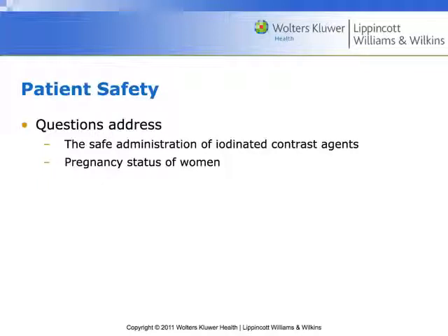The CT power injector, it's got pressure limits that are well above, for example, the pressure in your car tire. Pressure in your car tire is like 30 PSI, right? That's what keeps your car going down the road. I might be hitting 200 PSI on my power injector, right? If you can imagine that sound that it makes when you push down on your tire and all the air flies out, that's air flying out, right? Not contrast. Contrast is borderline heavy metal, iodine, right? Very viscous, and I'm pushing it really hard through a very tiny bore of an intravenous catheter.